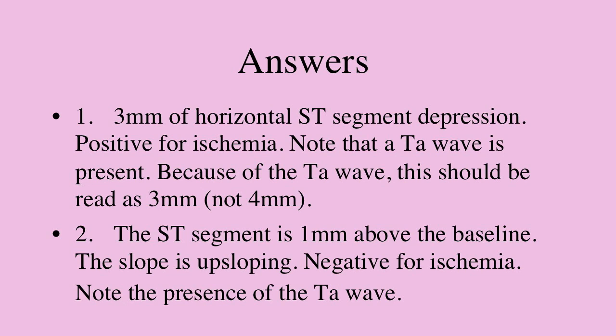And that's a pretty important part of this course, because a lot of clinical exercise physiologists will be reading EKGs and making a diagnosis and determining, or helping, as part of the team, determine the fate of the patient from there. So that's under the category of abnormal EKG response during graded exercise testing. That's the most important area to study and really understand, is that idea of ischemia and all of the reading of that.